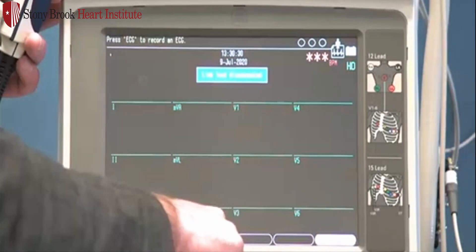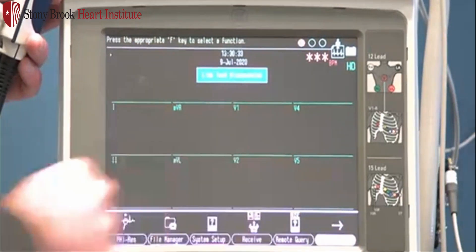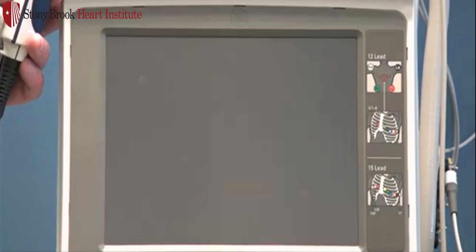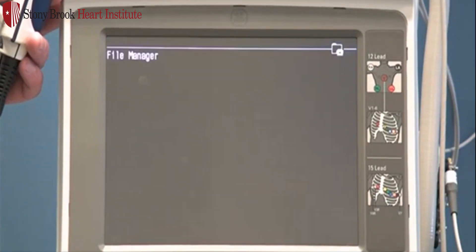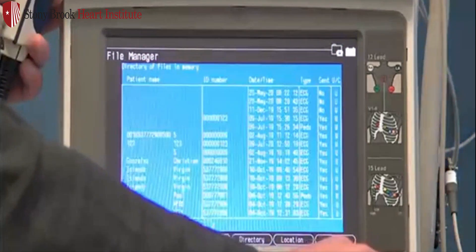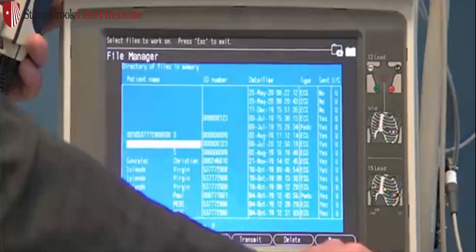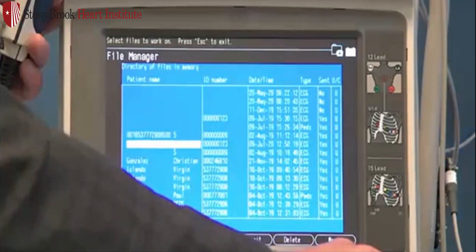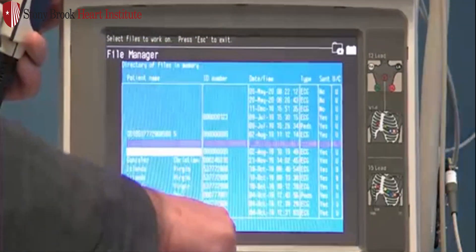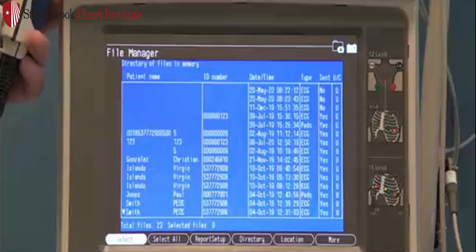That will take us to the main menu, F3. I can also press F6 again to move to my file manager, which will be F2. Once I'm in my file manager, I can select the study from my list, maneuver down, use Enter to select that patient, and then F4 to transmit. It will tell you that it's transmitting and confirm once it's successful.